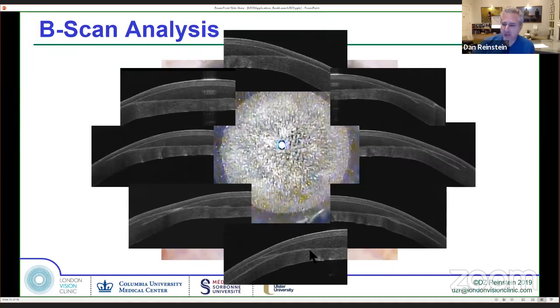So we have a high myopia smile study that we were running. And there is the interface that I should have crossed to the edge of the lenticule, but the instrument jumped down and went and created a false plane. And around here, we see another angle of that. Here it's joined. So now when I've sat in front of this thing for 10 minutes and thought about it, now I'm able to draw a diagram. And I'm able to draw a diagram that tells me exactly which region I have falsified a plane and where I have not falsified.